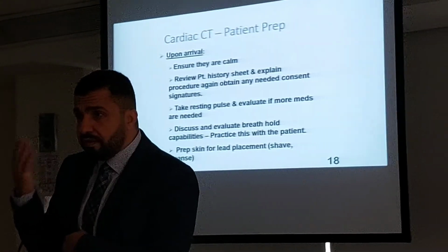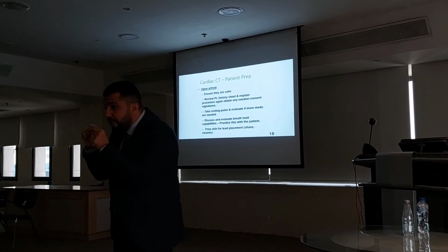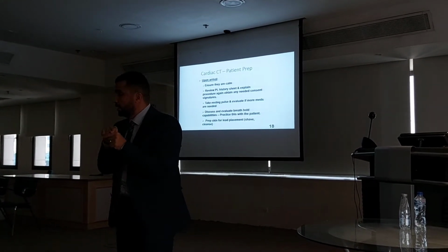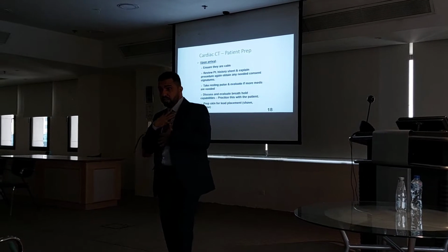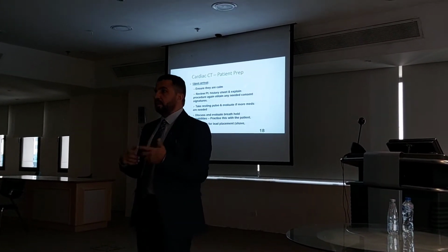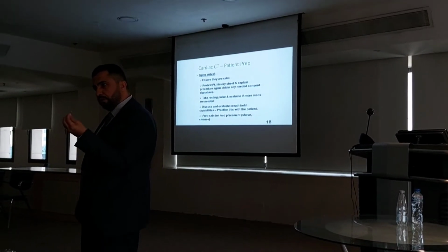That's it. You don't think that it's really important? I will train him how to take a breath. Some patients will take a breath from the stomach, and that's not good. Some patients do shallow breaths, and that's not good. Why do I need him to take a good breath?